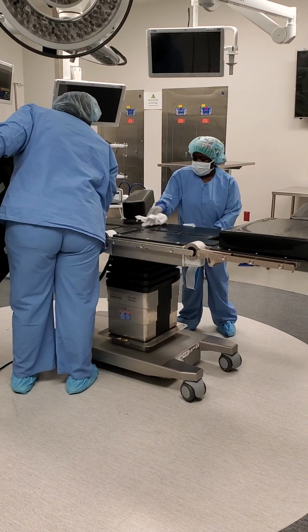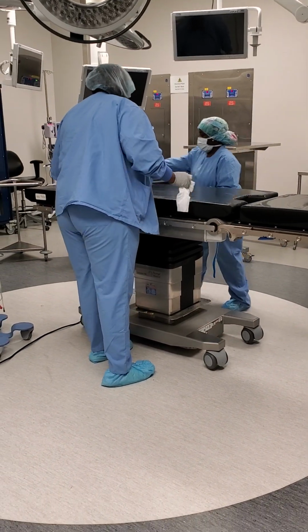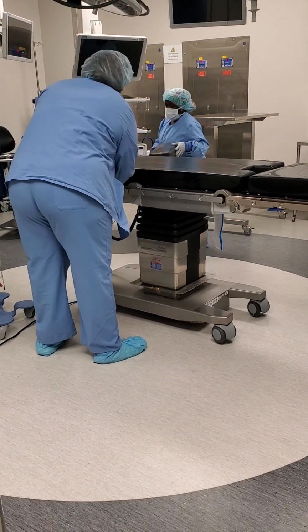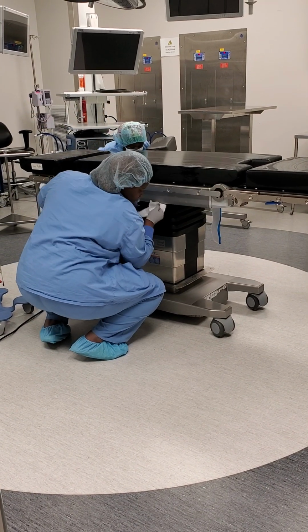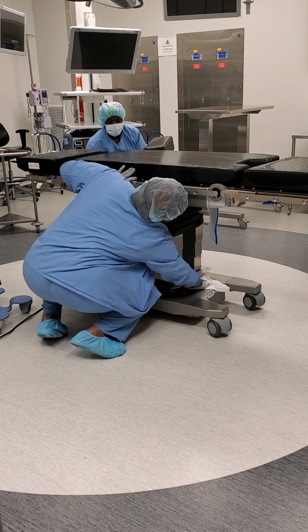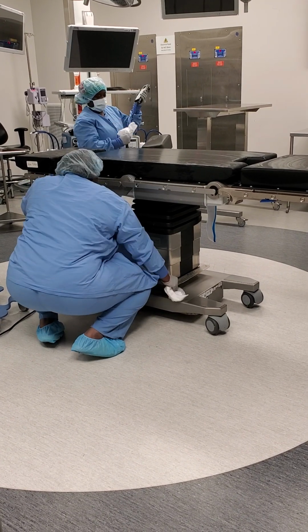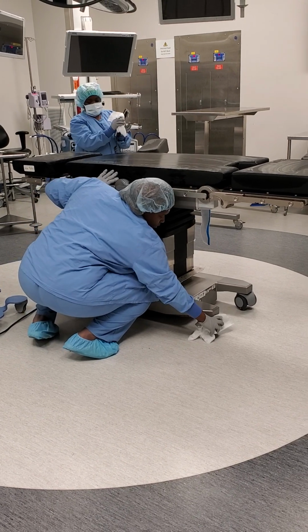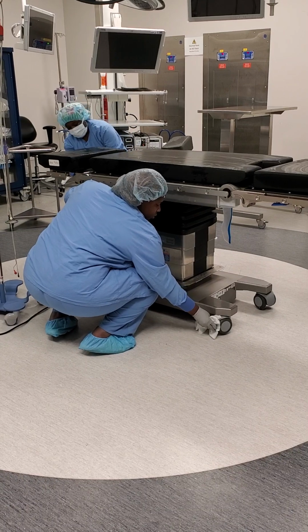The last area of the bed to be cleaned is the base, cleaning down the pedestal to the base. Making sure if there's anything stuck in the wheels, we remove it. If the SCD machine is on the bed, we want to check the cords to make sure there's no blood on them. If there were, we would remove the cord and replace it with a new one, or try to wipe off the blood.